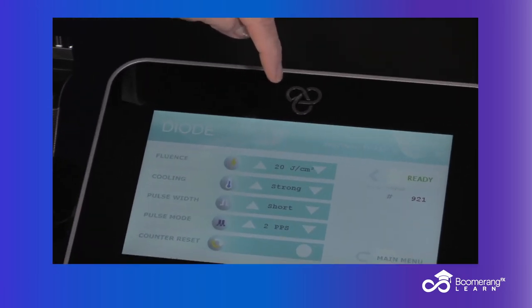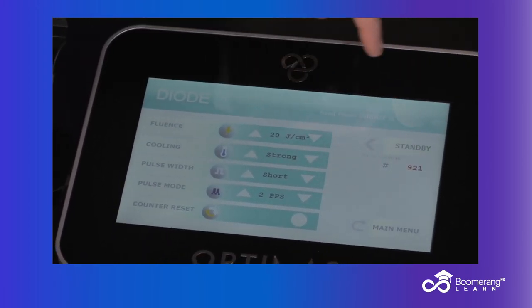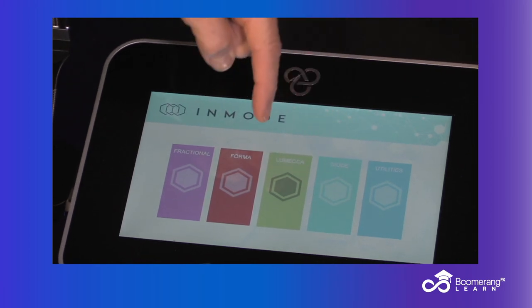We're going to go back to the menu on our multiple applicator Optimus. If you're ready, go back to the main menu. We're going to go from diode and hair removal right to photofacial.